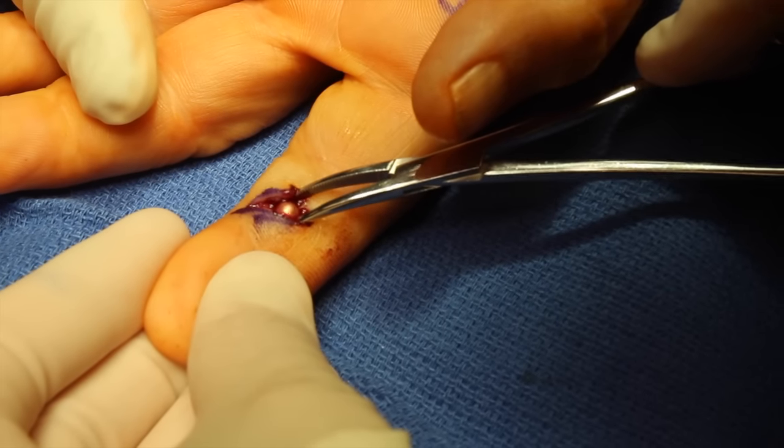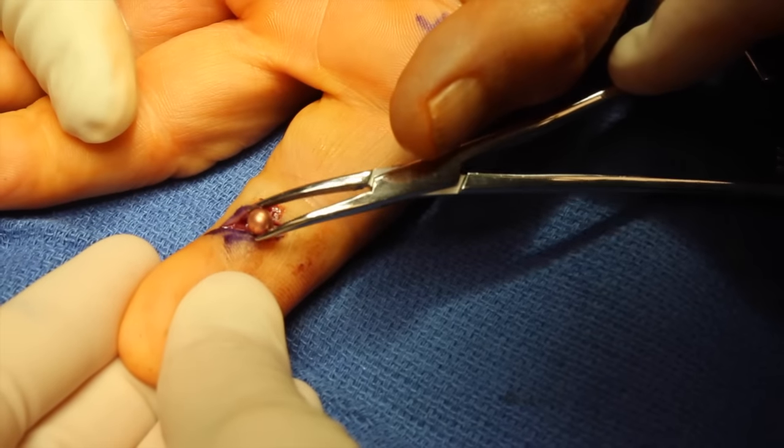I can simply retrieve the BB and then wash it out, and close it up with simple nylons.